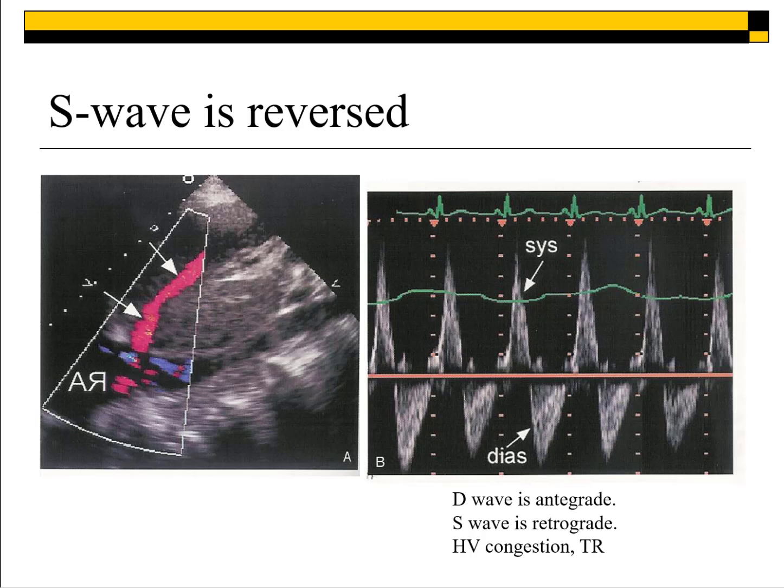So here's an example of severe tricuspid valve regurgitation. Remember that the tricuspid valve's not working correctly, it's leaking, it's allowing blood flow to go the wrong direction. So in this situation, we're seeing the ASV complex. The ASV are all blending together now above the baseline going retrograde. The only time we're having antegrade flow in the severe case of tricuspid valve regurgitation, so remember this is severe, is during the filling of the right atrium during ventricular diastole.